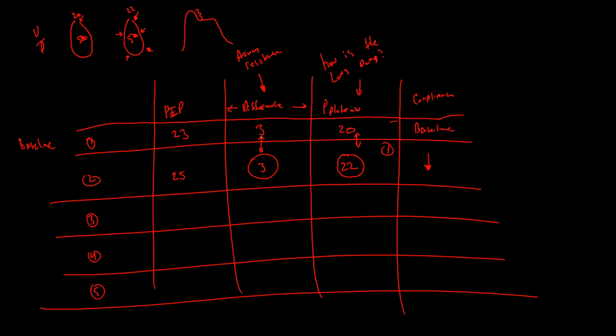Well, we had an airway resistance of 3 before. We have an airway resistance of 3 now. That means the airway resistance has stayed the same.